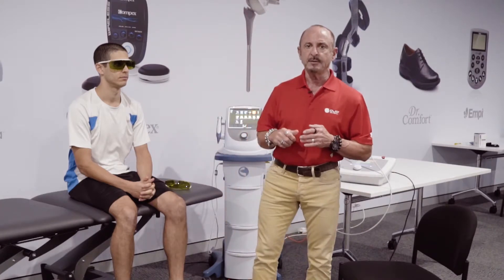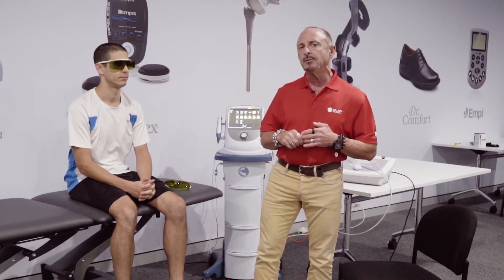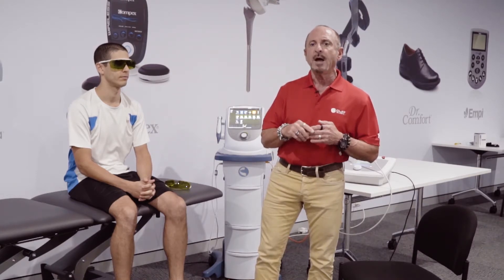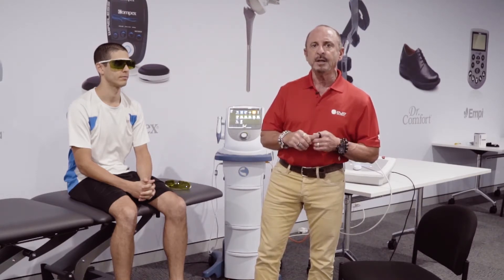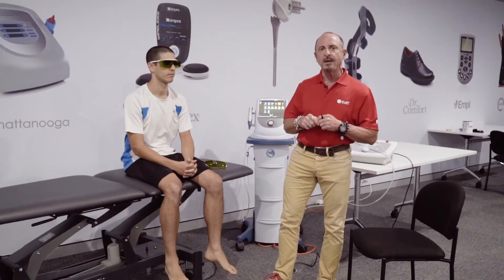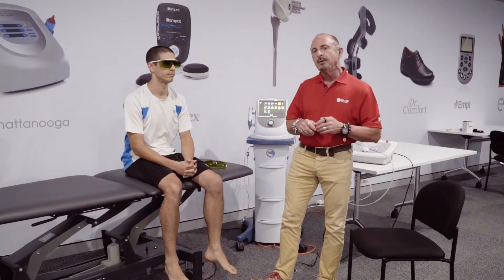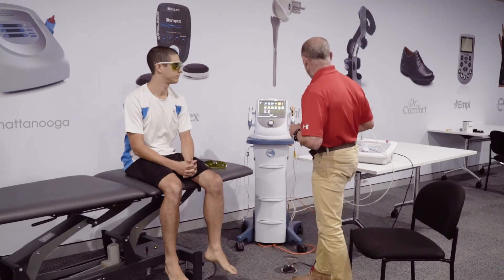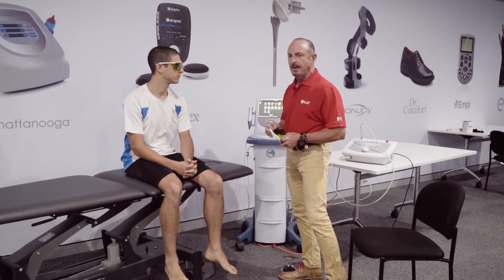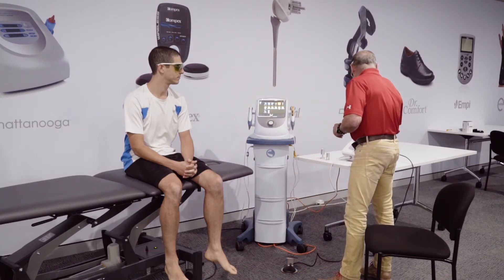On top of that, we're utilizing the stochastic emission mode, which is exclusive to Chattanooga. It prohibits accommodation into the tissue at the cellular level, because with this we're working at the cellular level using a whole lot of energy. Coming over to the user interface to begin our treatment — always glasses up first.